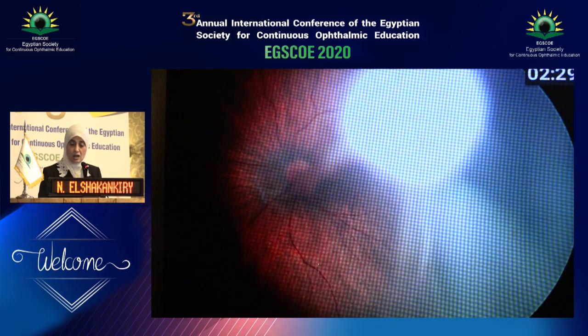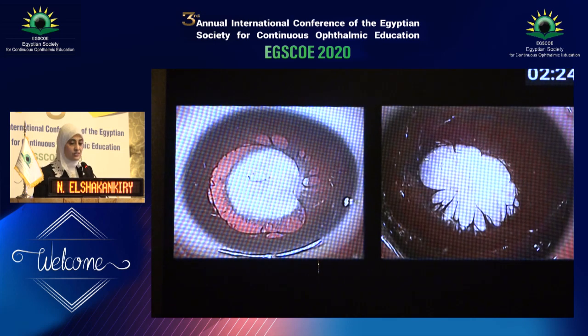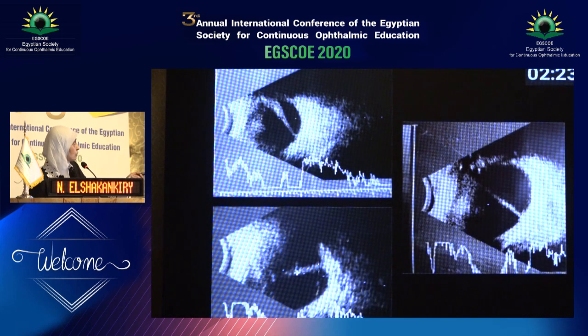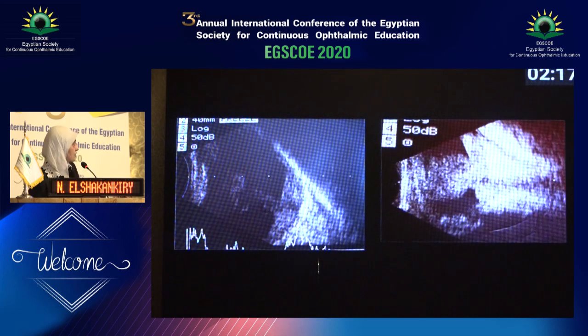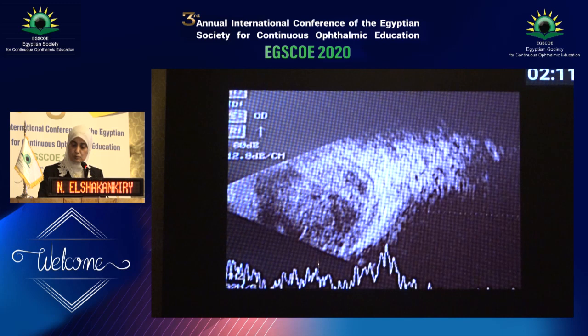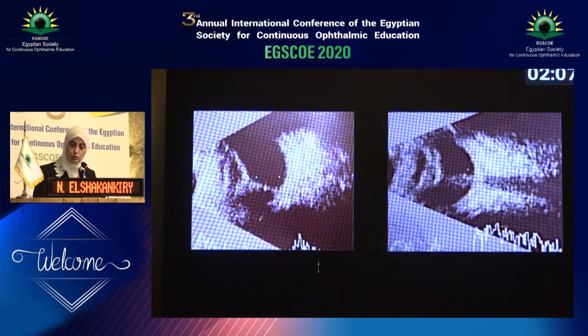We don't operate when the macular area is affected. And in dense cases, we perform ultrasound and we can judge. The hyaloid artery may be thin, maybe moderately thick, or maybe extensively thick and associated even with thickening of the retina, and sometimes so severe that an MRI is needed to confirm the diagnosis.